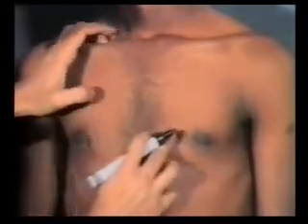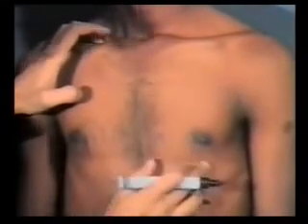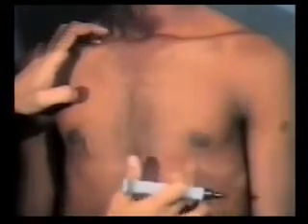The points are marked as follows. Palpate the sternal angle. The space just below the sternal angle is the second intercostal space. Mark the fourth intercostal space at right sternal border as V1. Then mark at the same level, that is in the fourth intercostal space at the left sternal border, as V2. Mark V4 in the mid-clavicular line in fifth intercostal space. The point midway between V2 and V4 is V3.